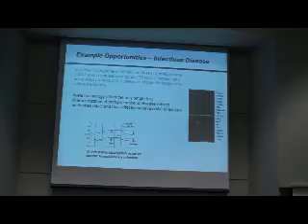So here we're looking for the presence of antibodies against all of these pathogens in one slide. Here we're actually using the real time to be able to determine whether a pregnant woman has an acute infection of toxoplasmosis, a parasite, or whether she's been exposed in the past. And the difference there is the fetus is tremendously susceptible to damage if there's an active infection. So decisions need to be made in the first trimester about treatment or other options.